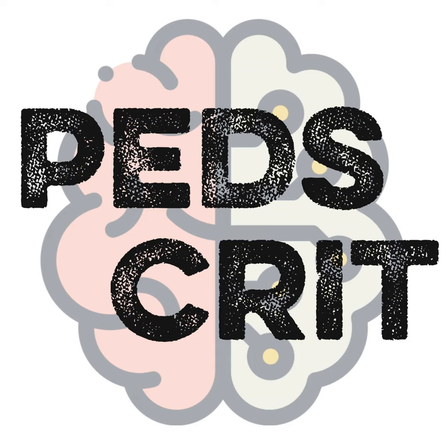So if there is an issue with CO2, or if they think that the amplitude is getting up because the resistance is increasing because of the secretions, then they do an extra suctioning. But definitely inline closed suctioning, because you get a massive derecruitment if you break open the circuit.